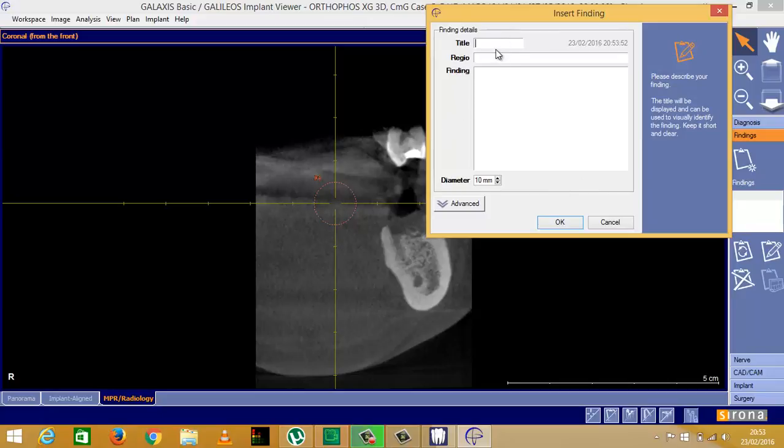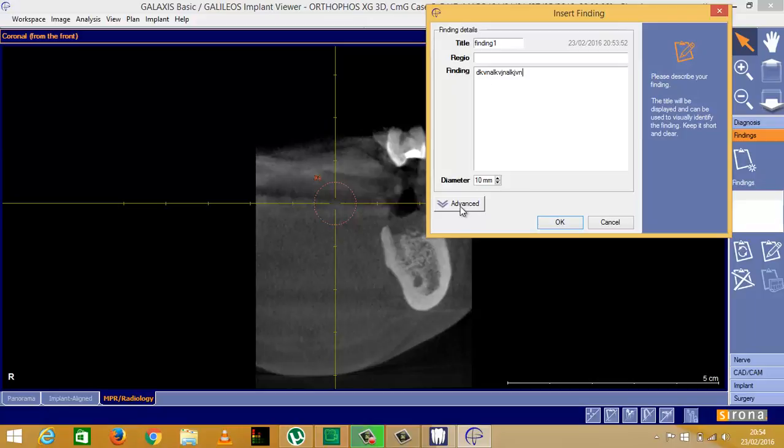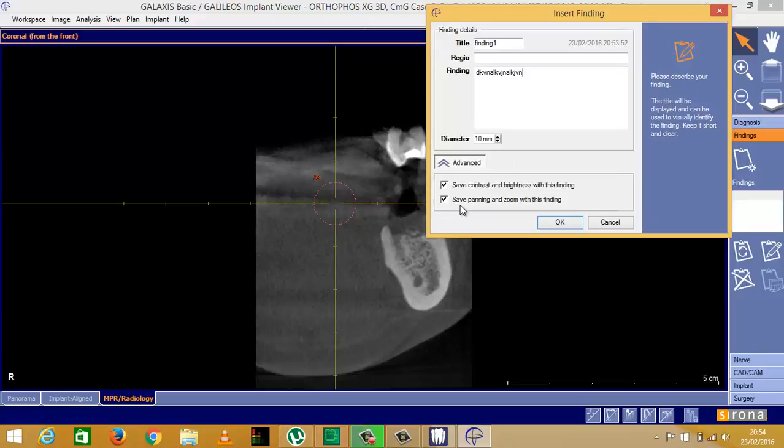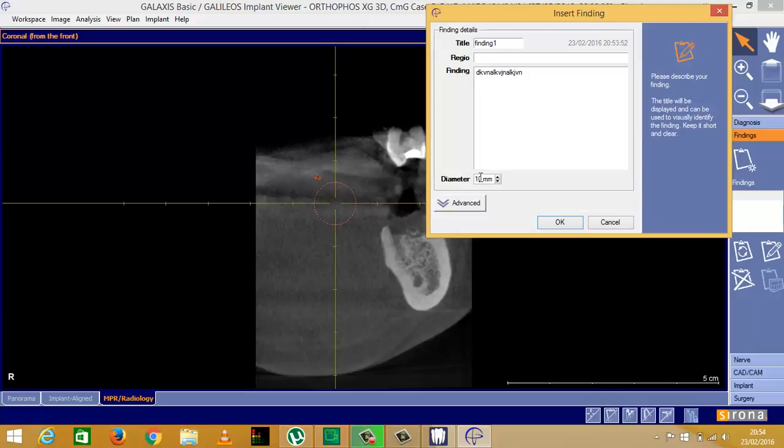Now you can give it a title. I'm going to call this one finding one. You can call it anything. Regio is the region, so you can add whatever you want there. Where it says finding, you just type whatever you want to say. You have a couple of advanced options here. Just click OK.